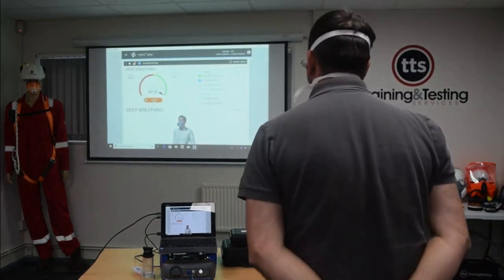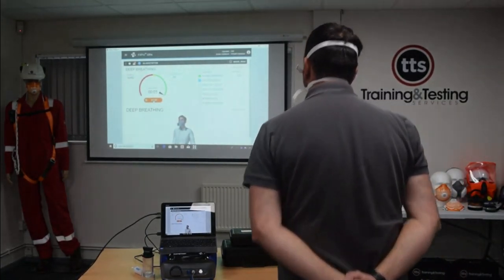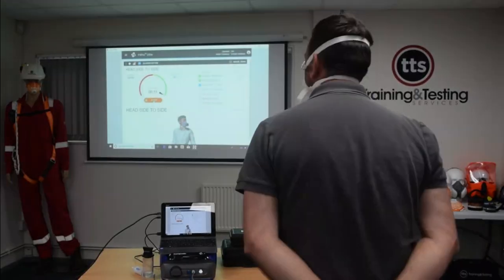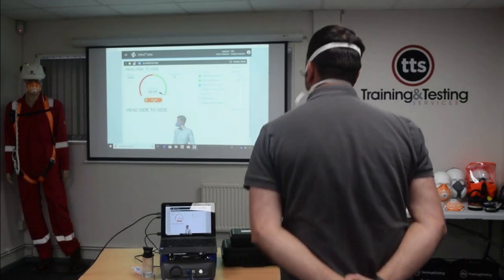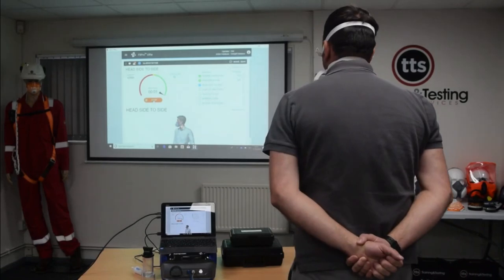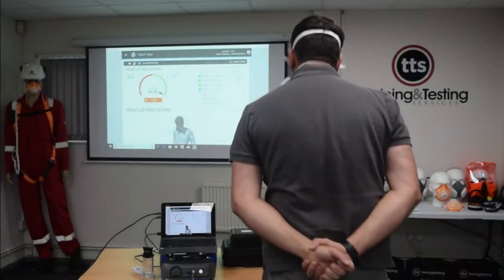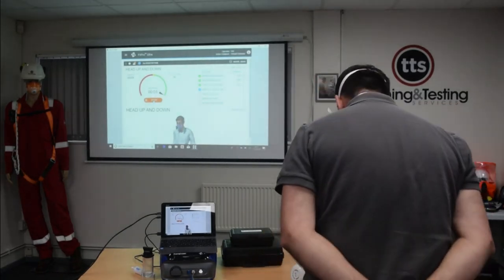The next exercise, when the machine beeps, we'll be switching back to normal breathing and turning my head from side to side while stepping on the step. The next exercise is head up and down while still maintaining the steps. The next exercise to complete is a talking exercise. I'm going to count backwards from 100 while maintaining the steps when the machine beeps.